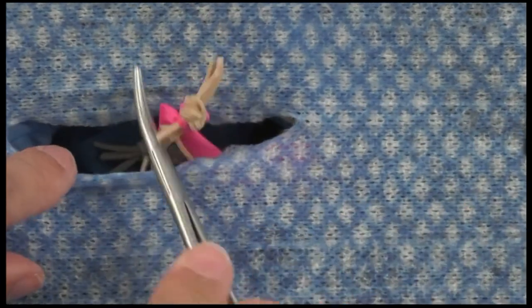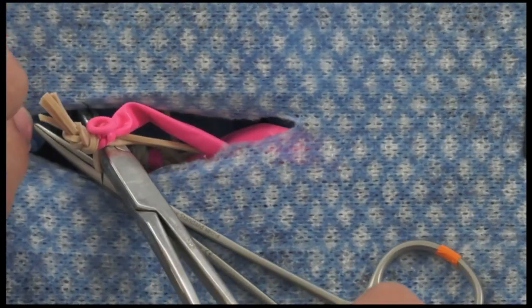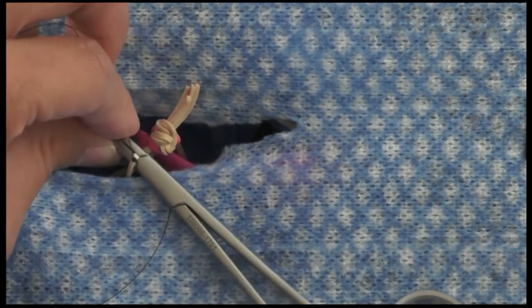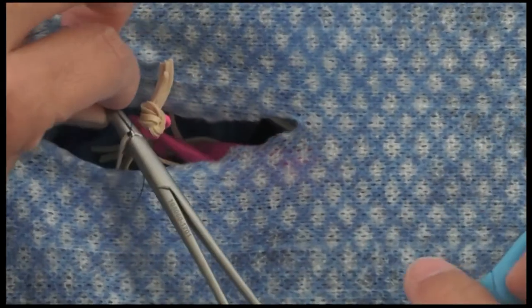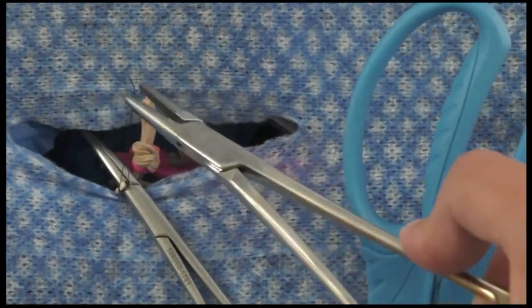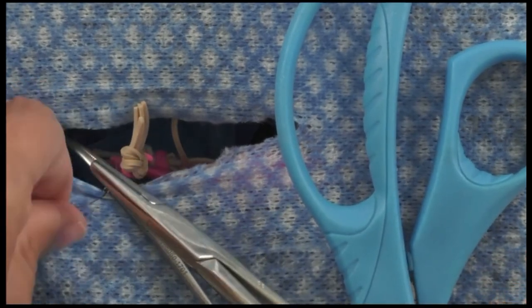Alternatively, if you've got a pair of Carmolts that can span across the incision, use that to help hold the ovary outside the body. If your hemostat is too small and wants to slip inside, use scissors in the ring holes to hold it out of the abdomen so you can see what you're doing. Make sure not to ligate structures outside the pedicle — inadvertently including fat from the subcutis or omentum makes the ligature less secure.